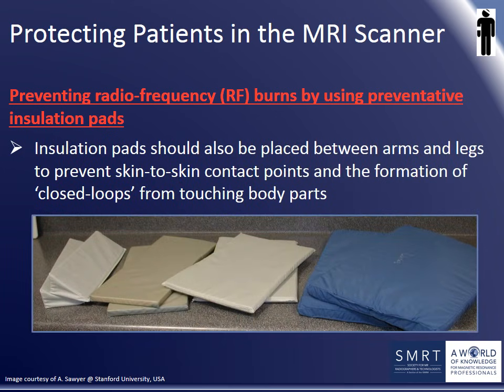Insulation pads should also be placed between the arms and legs of patients to prevent skin-to-skin contact points forming potential circuits for conducting heat energy from touching body parts.